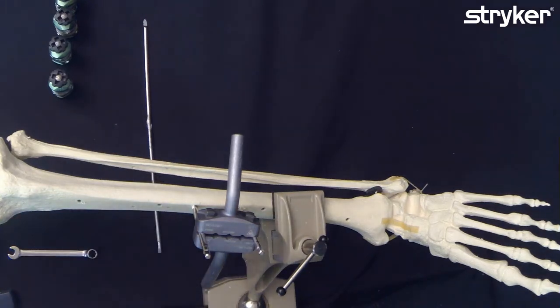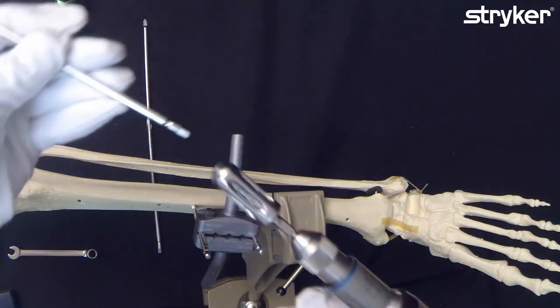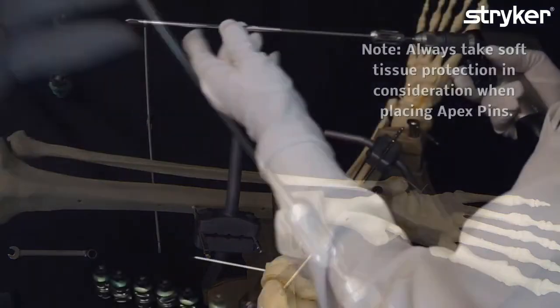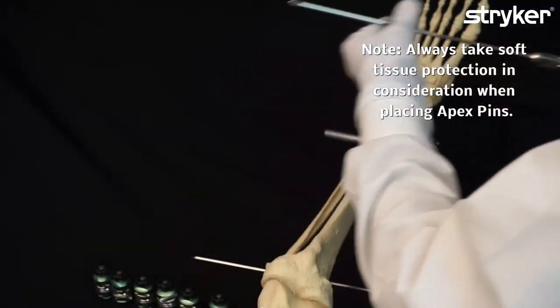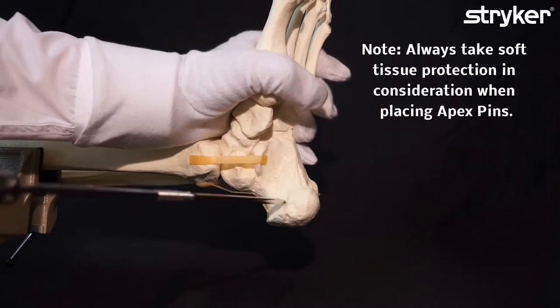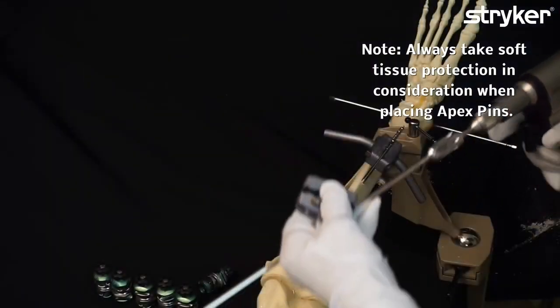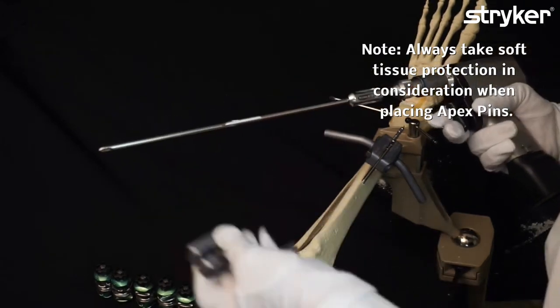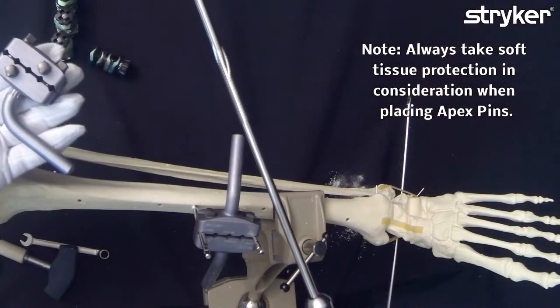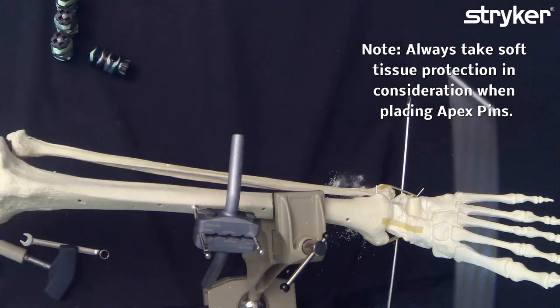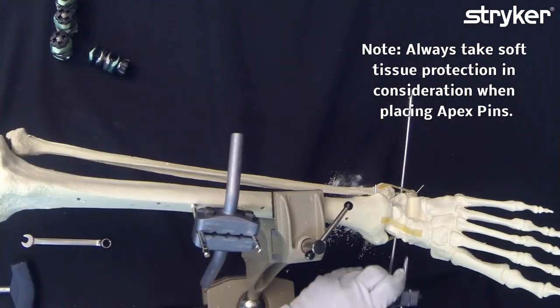Then the next step is to insert the transfixing pins of five millimeter to six millimeter transfixing pins with a quick chuck. We take a 90-degree post in a five-hole pin clamp and place it over.